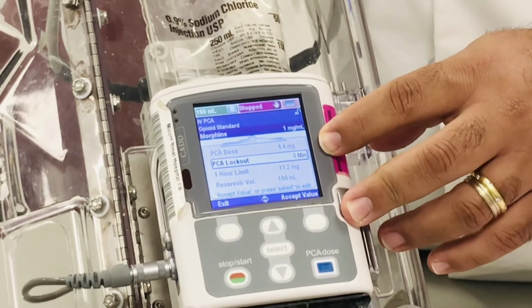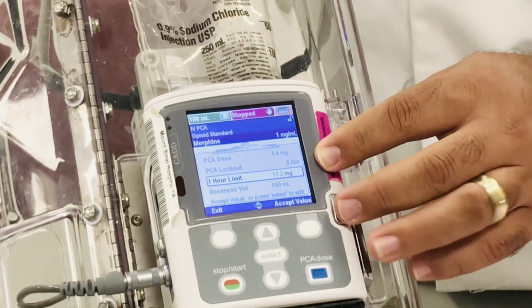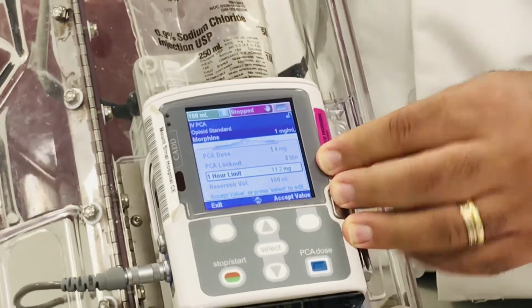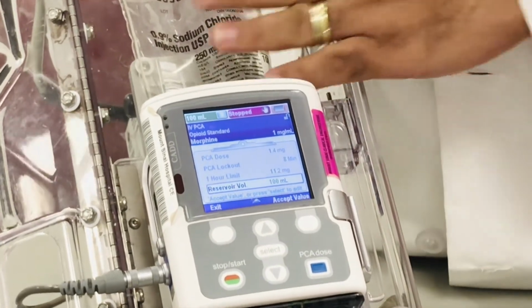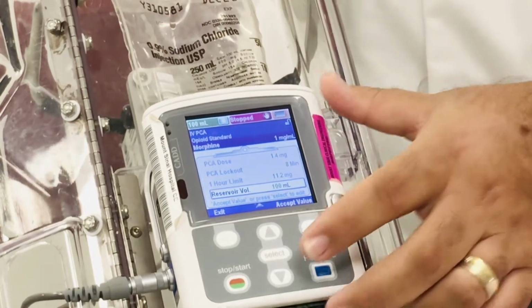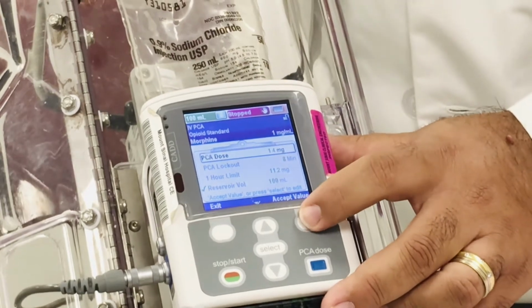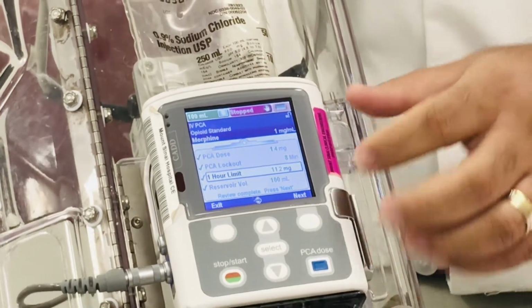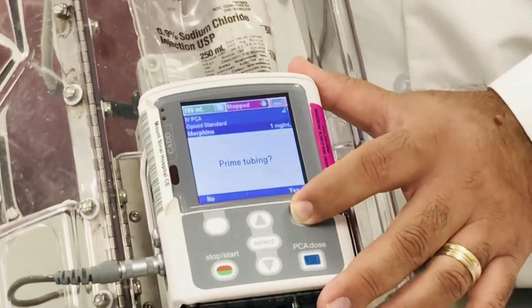They could only get one dose every 8 minutes. In 1 hour, the max dose of morphine that the patient will get is 11.2 milligrams, and the reservoir is right now at 100% or 100 mLs because we have not primed the bag. Once we do this, we accept all the values, we accept everything, and you'll see that there is a check mark that comes up. Once you get the 4 check marks, you're going to hit next.